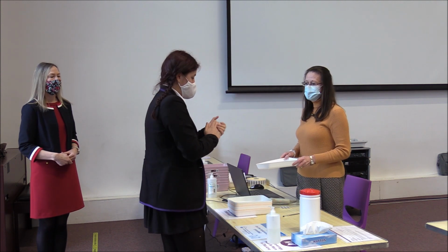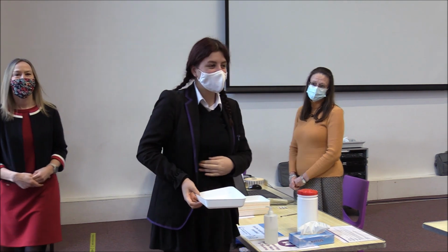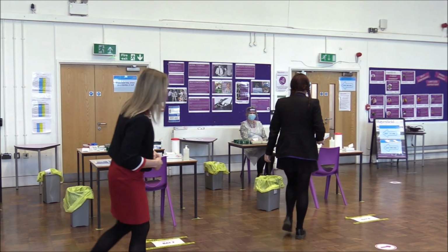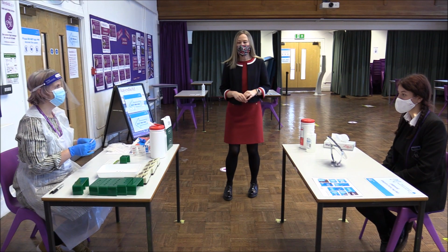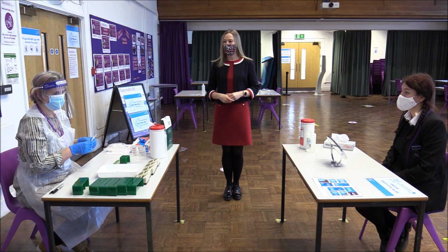And then if you can take this tray with you, and then the next thing is to go to your testing bay. Okay, so if you want to follow us, so you'll be told to go to a testing bay number, and Isabel is going to go to testing bay number 8. Okay, so Isabel has sat down in her testing station, and she's handed her barcode to the test operative.